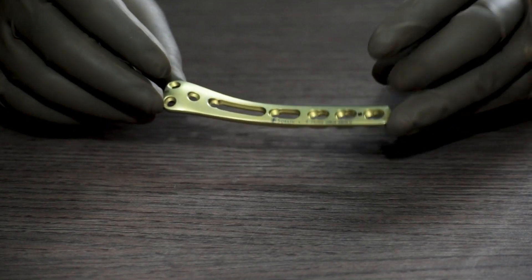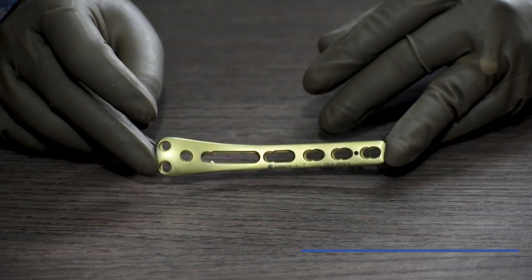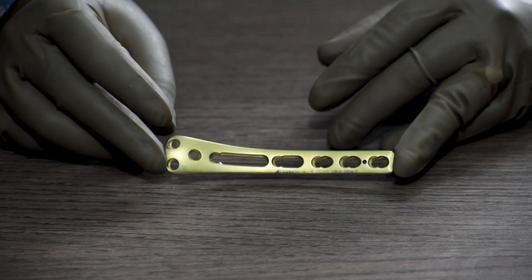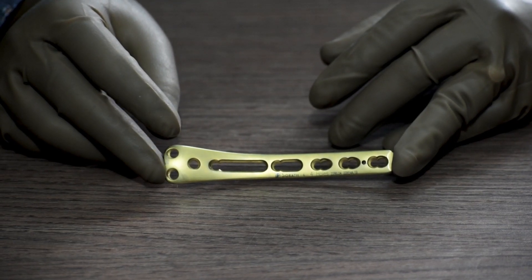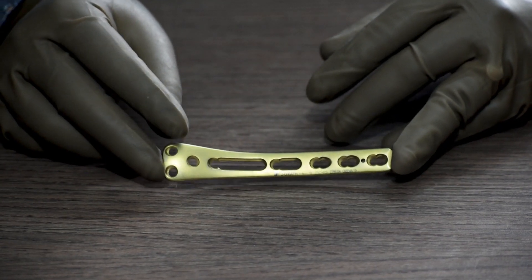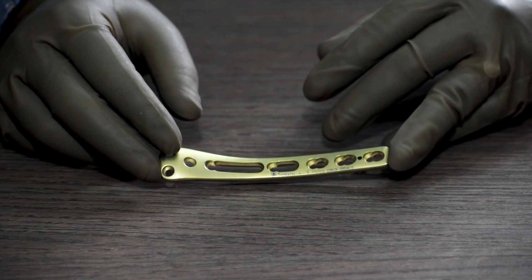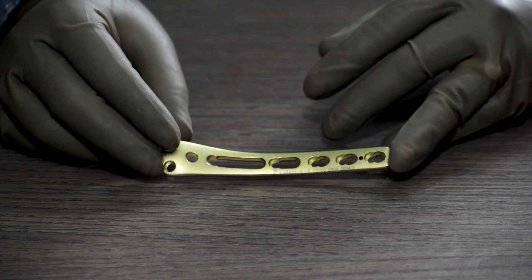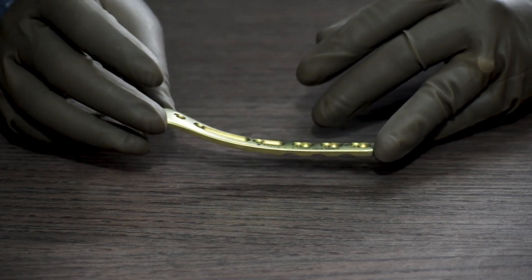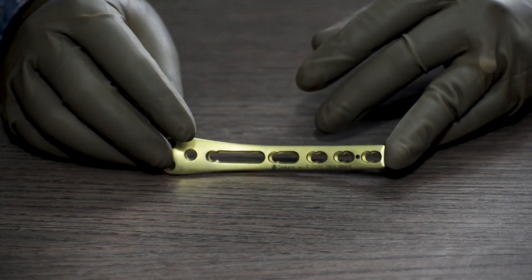Next is the proximal tibia posterior medial plate. This gets fixed in the medial and posterior side of tibia. It is also available in different sizes starting from 4 holes up to 12 holes with 2 holes difference in between. This is a universal plate.